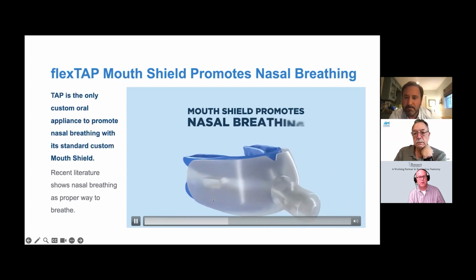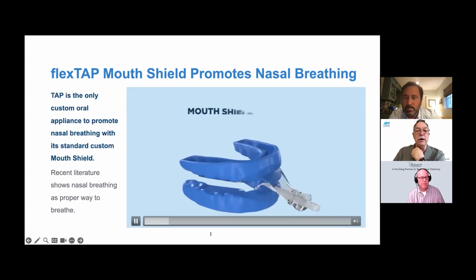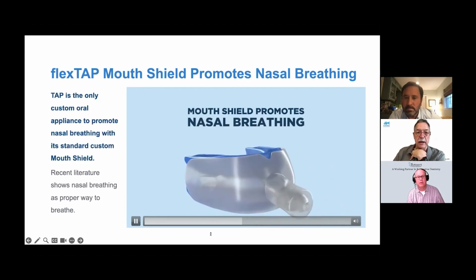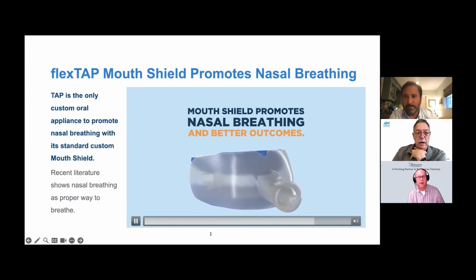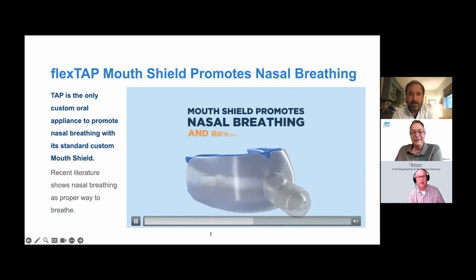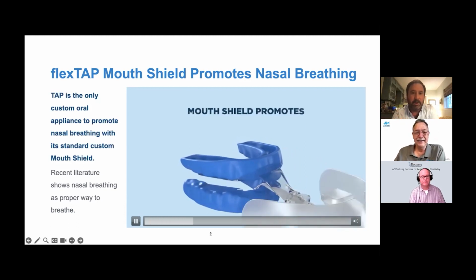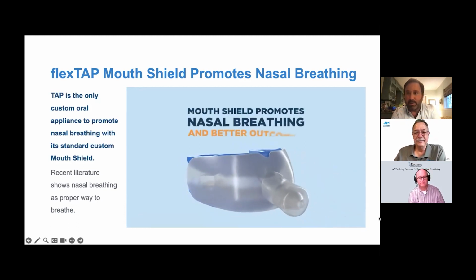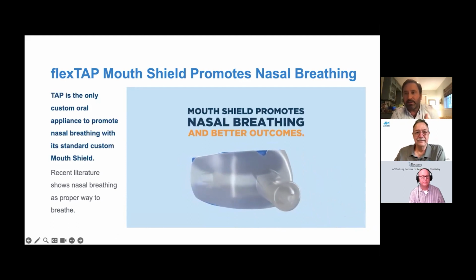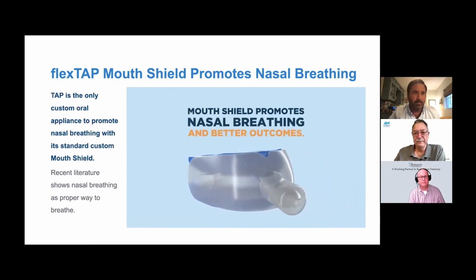Yeah. Okay. I had one patient try without the nasal breathing trainer. They couldn't really tell much difference because their lips come together anyway. And so I said, I'm not going to argue with you. If you're going to use it, I'm good. And kind of going back to the acclimation period, I've had some doctors say they like the patient to get used to the mouthpiece itself first and then add the mouth shield, but I think it's about giving the patient the options.